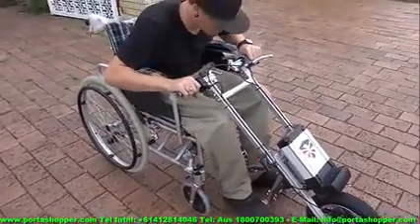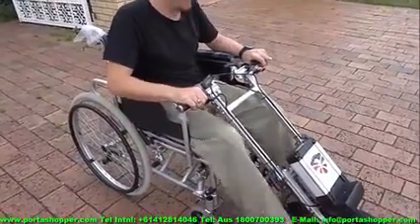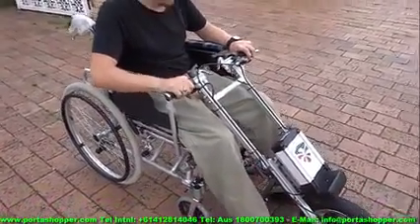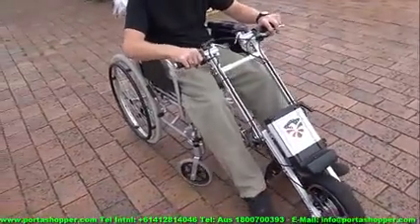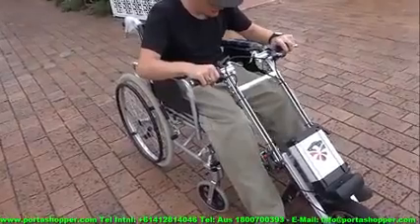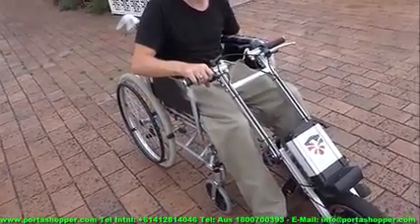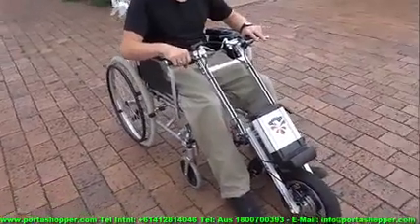Just to let you know, the instructions in this video are for both the 380 Porter Wheel, which is a 380 watt model, as well as the 680 Turbo or 680 watt model. This video will demonstrate some key points when you set up your new Porter Wheel, and the first is to make sure that your brakes are on when hitching up and reversing.